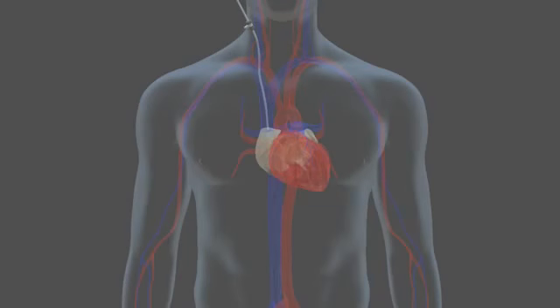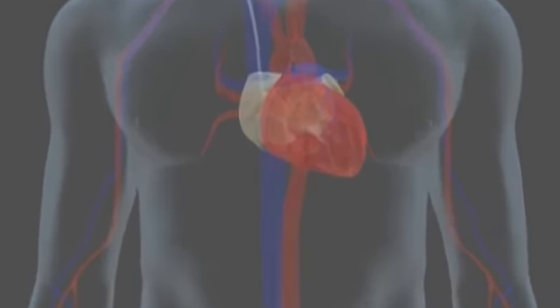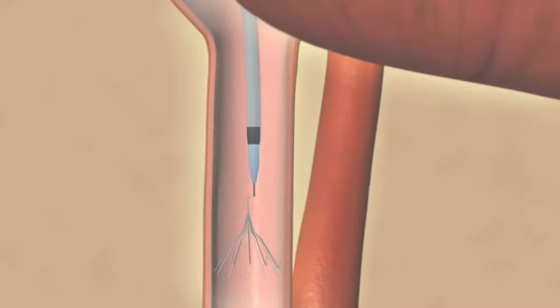To remove a temporary inferior vena cava filter, advance a vena cava removal system over a wire to a point just proximal to the temporary vena cava filter. Withdraw any internal dilators or components and advance the Snare system through the appropriately sized IVC filter removal sheath.